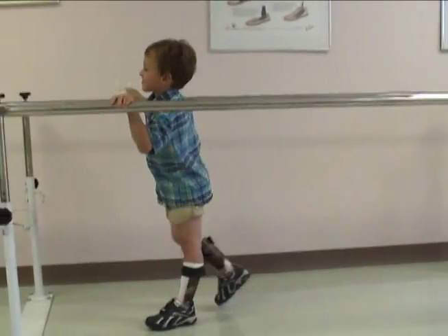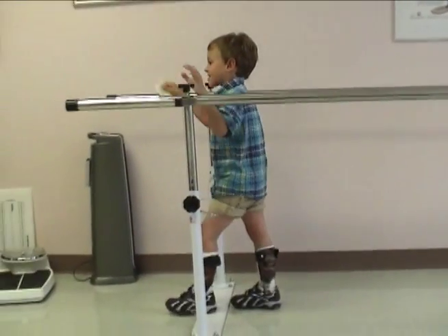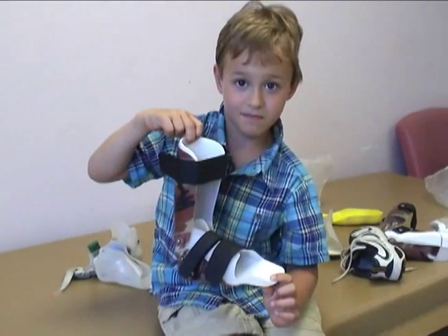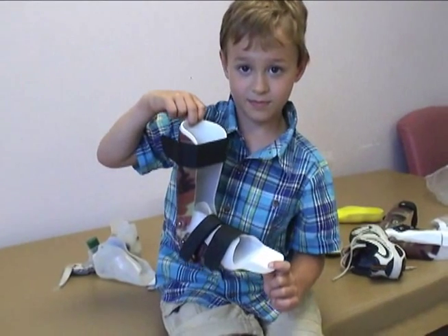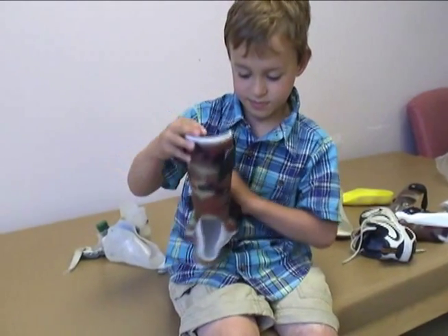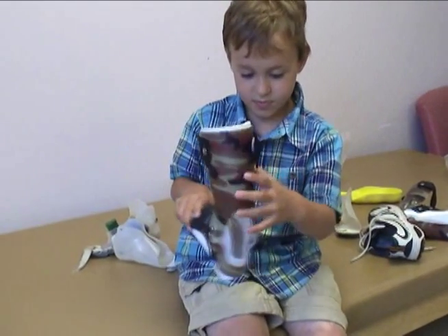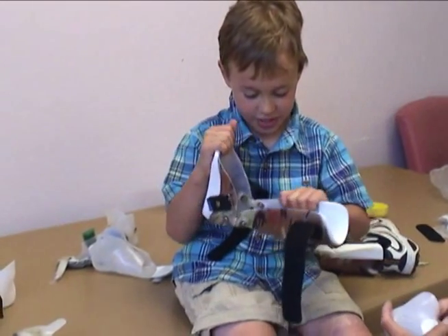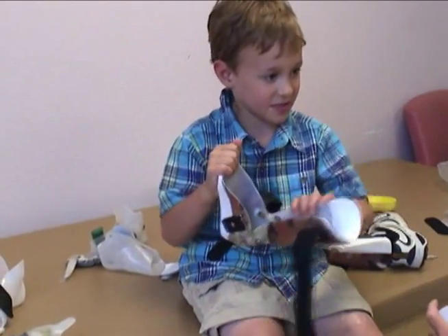Austin is in our clinic to pick up his new TAMI-2 braces. He most closely relates to our hyperextension patient category. The therapist was hoping to see, after some habituation, that Austin can demonstrate more successful control of his knee in the sagittal plane as a result of the resistance to plantar flex positions that the TAMI-2 provides.